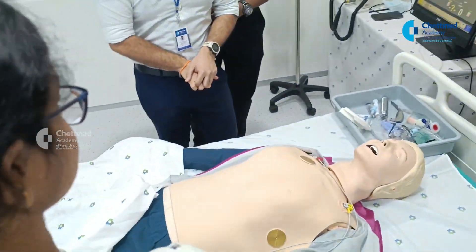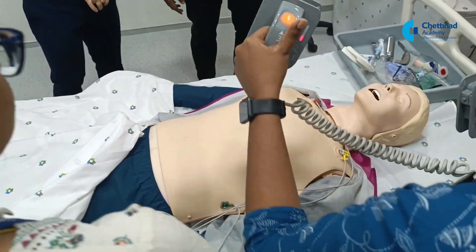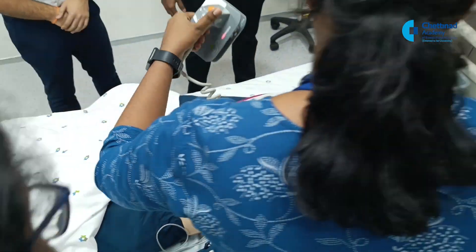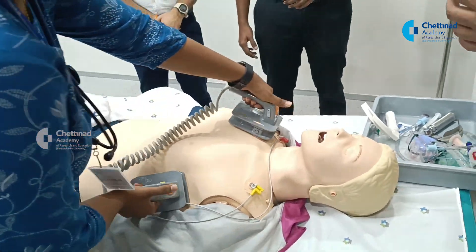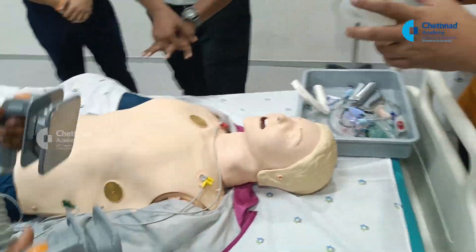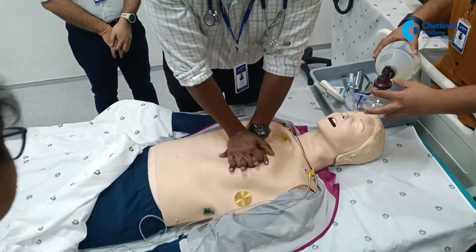Can you give the shock? Yes, sir. Let's not delay the shock. Let's give the first shock. Delivered. Okay, first shock given. Resume compressions.